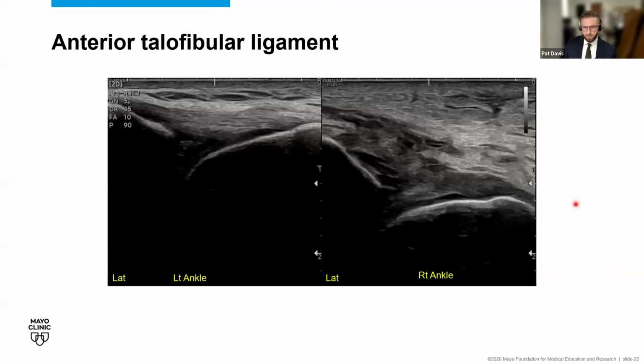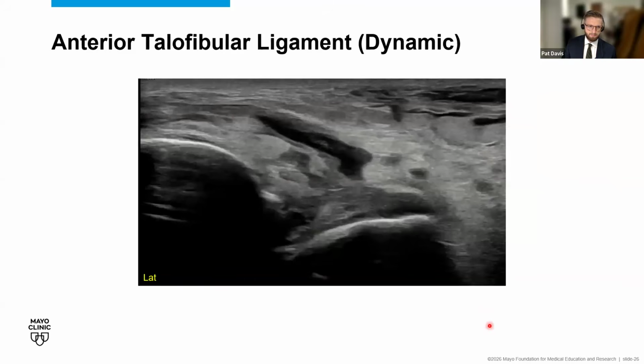We had mentioned a lateral ankle sprain mechanism, so you want to be concerned with tearing of your ATFL. So these lateral structures were added due to that mechanism of injury, so we won't spend as much time highlighting them, but I think it is important to go through exactly what we were evaluating here. In this comparison, on the left, you'll see the uninjured ATFL, where on the right, you will see the injured ATFL. The right one appears thickened, hypoechoic, with undersurface fiber tearing, anechoic areas consistent with a high-grade partial thickness tear.